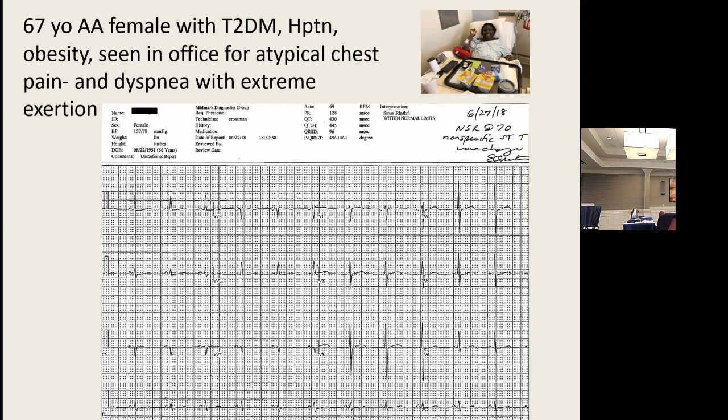So put all this in perspective. You can learn everything you need to know about EKGs. I call it a 70% test. It's about 70% of the time helpful, and 30% of the time it does you no good, because it does not help you. The only thing here that would throw me, it would say, it's non-specific, it's abnormal, it's not, but you know what? Her symptoms drive where she went with her treatment. And so I want to leave you with the idea that you learn the skills. You learn by covering up the interpretation and looking at it first, interpreting it, then exposing the interpretation and going, oh yeah, I see why that is. Or maybe asking the question like, oh, why is that? Because I didn't see it, and that's the way you build your skills with EKGs.